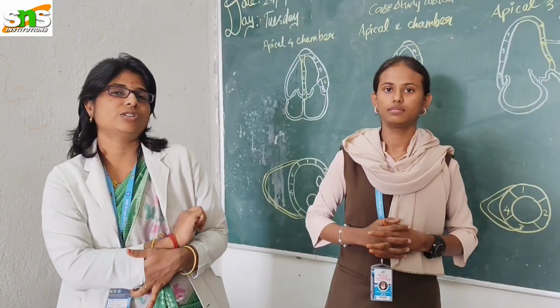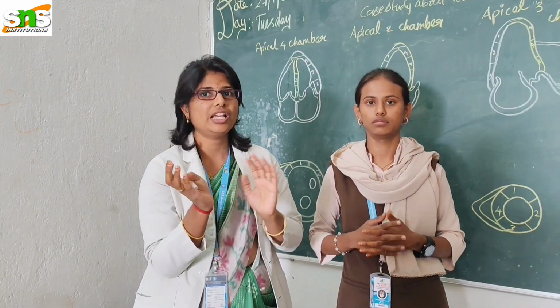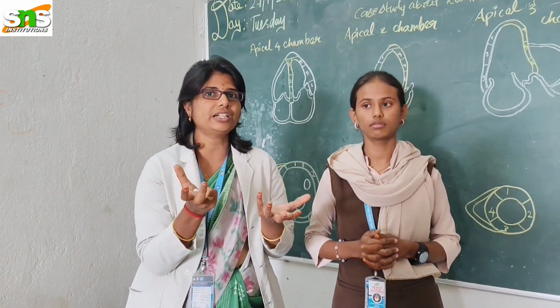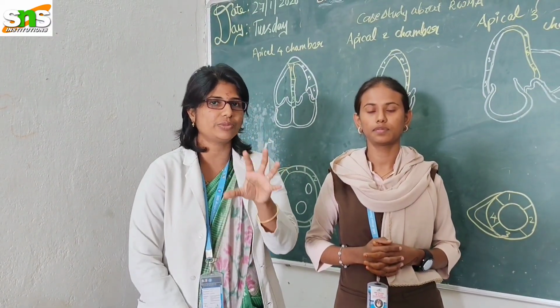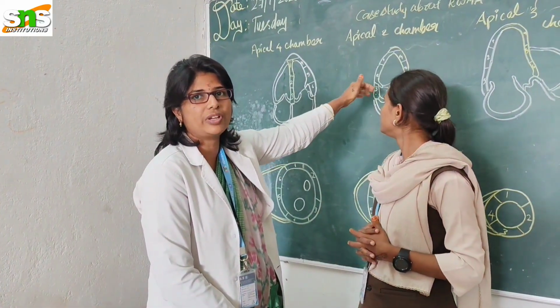Okay. So in early ischemia, the LV may appear normal, however in prolonged ischemia the LV appears dilated, with ventricular remodeling and a dilated size. Global dysfunction will also be noted. And in ischemic heart disease, we have to find out which artery has been occluded.